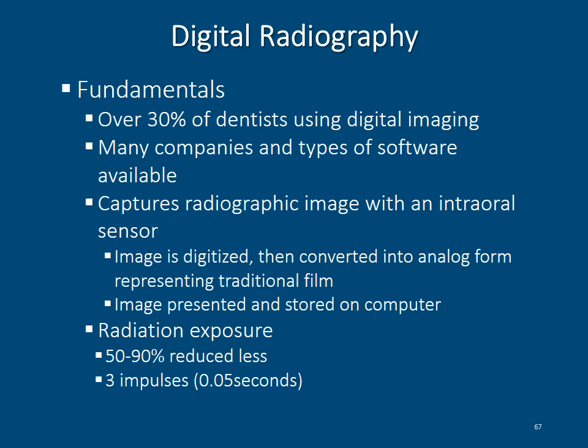Digital radiography has become very popular in dentistry. Over 30% and probably even a larger percentage of dentists are now using digital imaging. Many companies and types of software are available, as are their intraoral sensors, which digitize the image and convert it into an analog form, which are then represented as a digital traditional film on the computer. Radiation exposure, depending on the quality of the sensor, can be reduced as much as 90%.